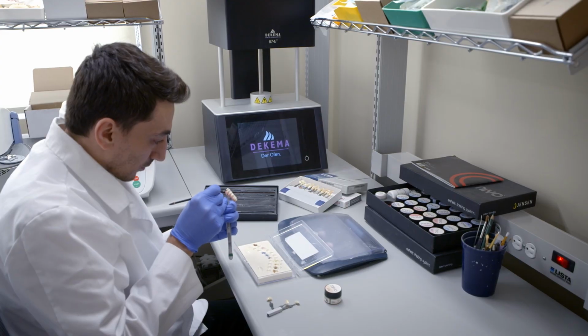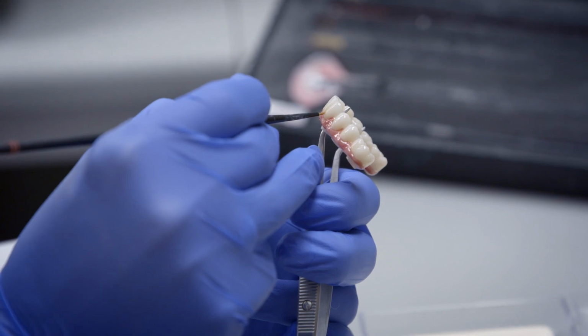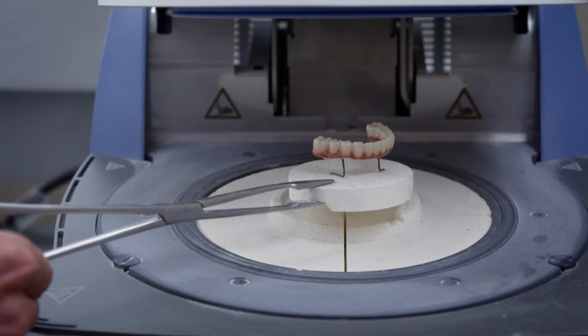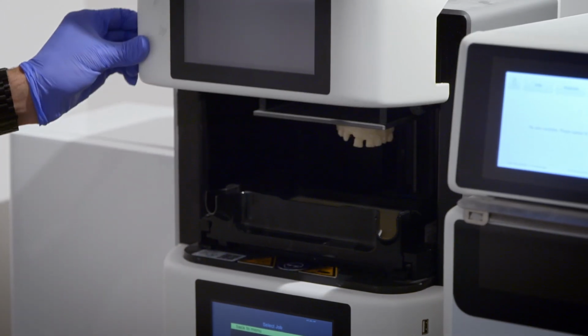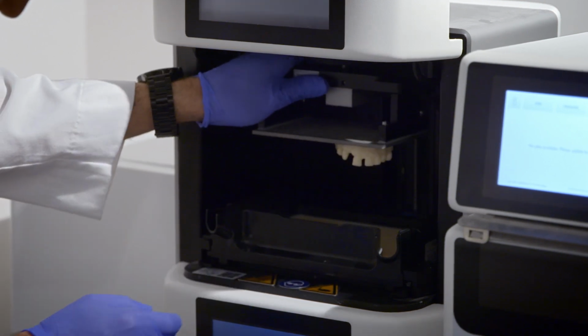After it comes out of the mill, it has to be stained and glazed and made the perfect color for the patient. So it goes in the oven there to bake into the right finished product. We can print models, which help us diagnose and help us plan things. We can print night guards, which will help protect all the work that we've done in the patient's mouth.